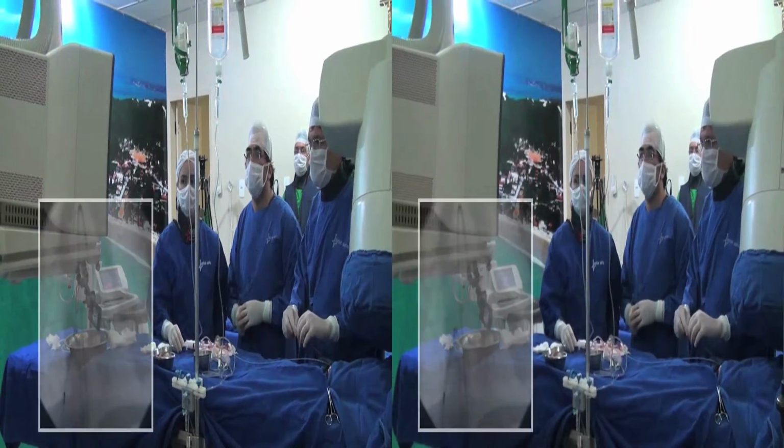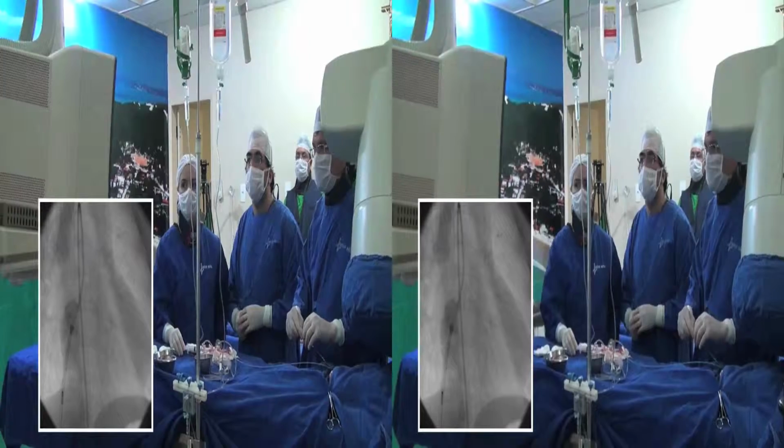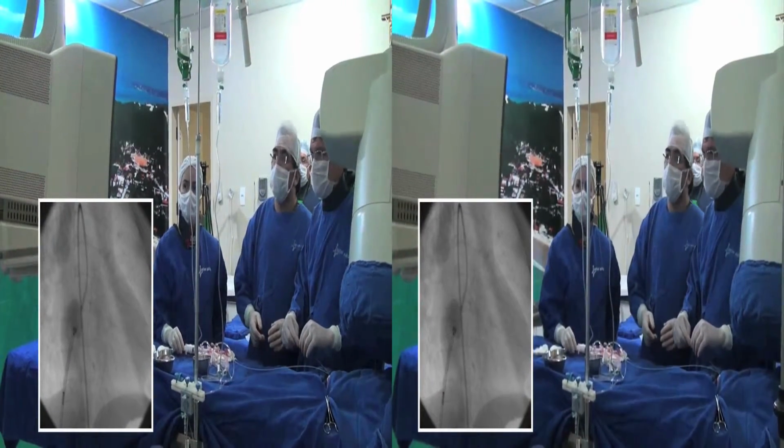For the prosthesis to sail, we changed the catheter and put an introducer 6F, and we can observe that it goes well straight into the introducer.